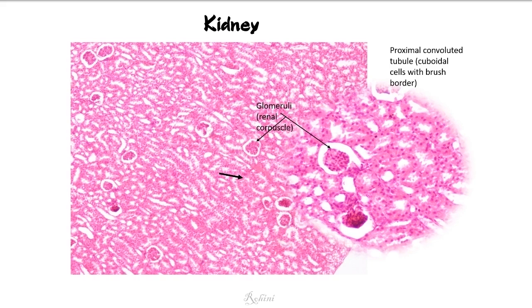The proximal convoluted tubules are numerous and can be identified since they are highly eosinophilic, with small lumen, single layer of cuboidal epithelium and brush border, microvilli. The distal convoluted tubules are fewer in number, have a large lumen, and cells stain lightly.